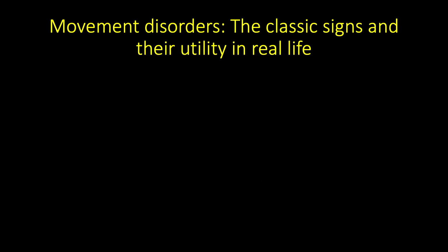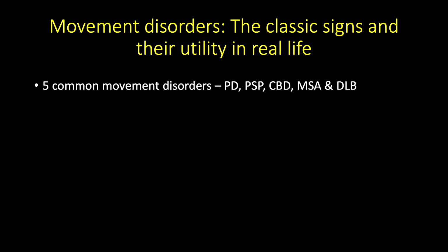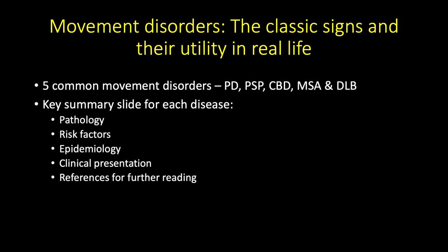And this talk is basically a very image and information-rich presentation of the 5 most common movement disorders that have imaging correlates. And I'm going to talk about each of them individually, starting with the most common and most important one for you to understand, which is Parkinson's disease.